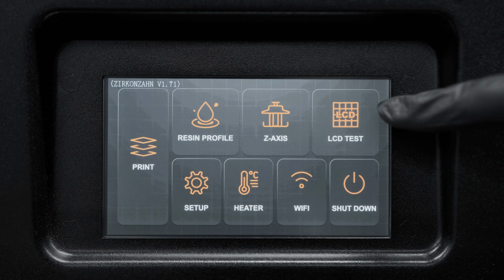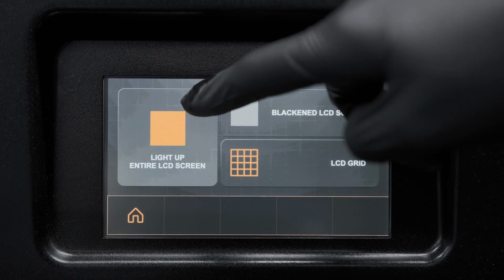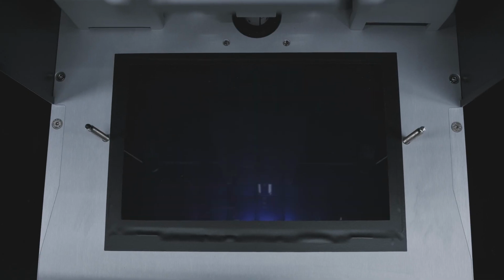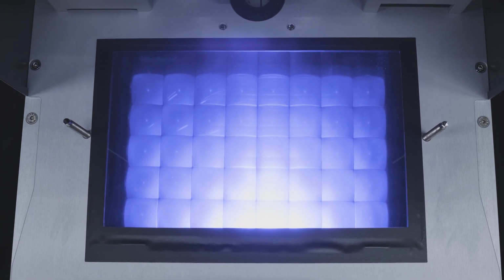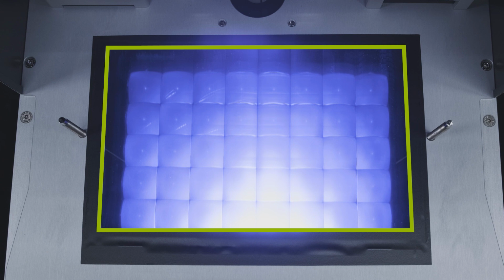Select LCD test and then light up the entire LCD screen. Once a bright blue square appears on the screen, check if all light bulbs light up. The display has to be completely bright, without black spots, circles or other shapes.